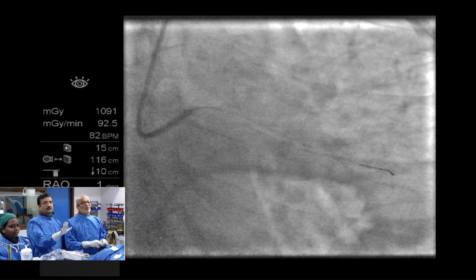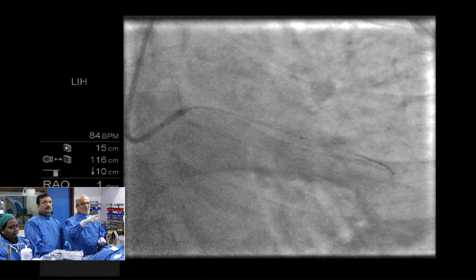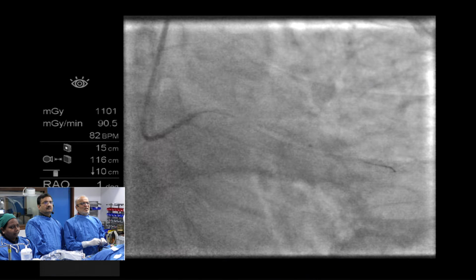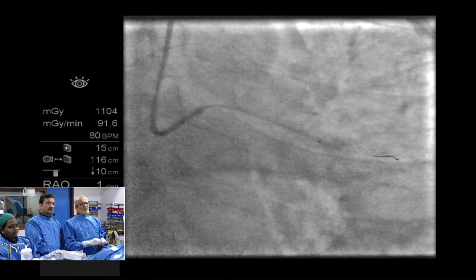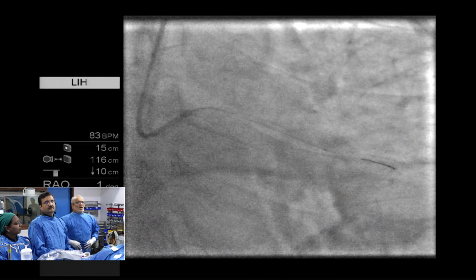It was not really so easy an area to move. I think the proximal stent struts were probably in the distal bifurcation, and a small area, negatively remodeled artery. Yes, we can't be so accurate, this is all right. I think that's not more than this.